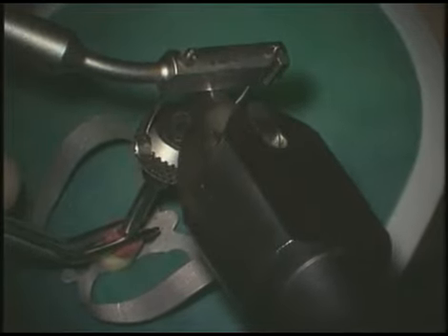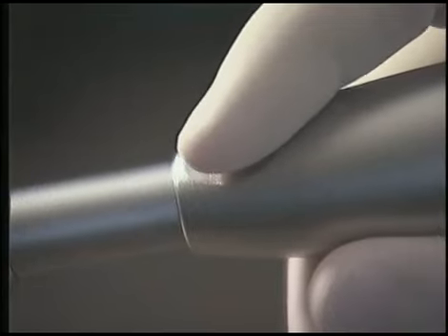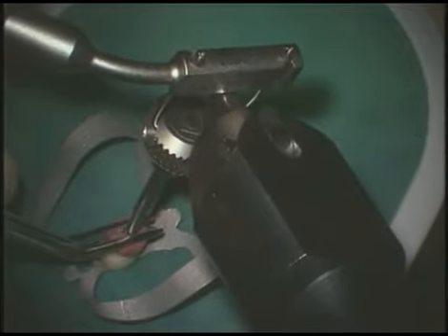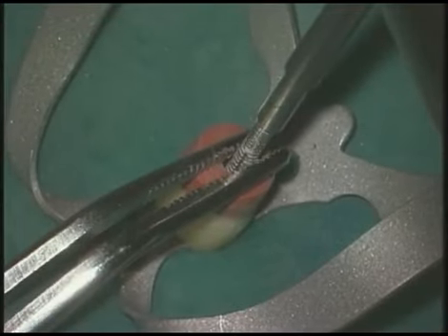Its tip will move 1/2 millimeter in a very controlled way. The finger activates the tip by moving across the valve. This delivers a very controlled force. This procedure is very safe in non-periodontally involved teeth.